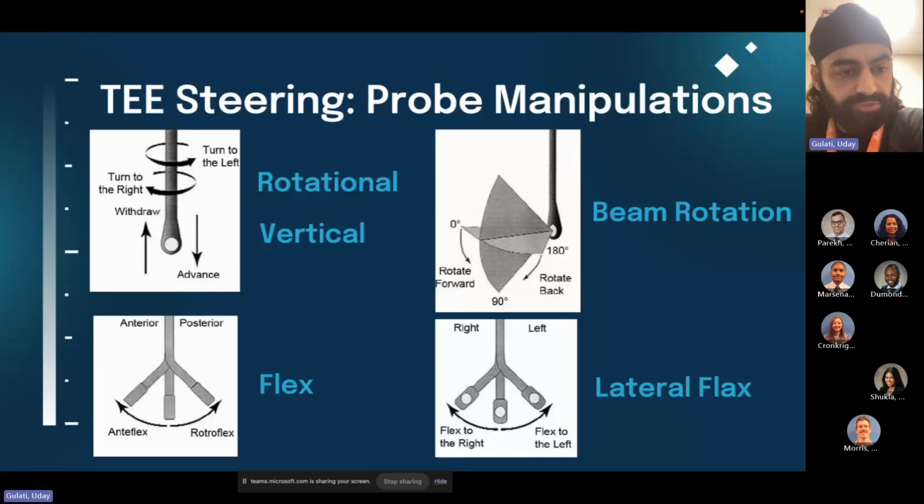So any questions on those 4 movements? Awesome. Yeah, so once again, there's 5 ways to maneuver. You'll primarily use 4, very, very controlled. And when you're using the probe, you're going to be able, at every point, to have specific instructions about exactly where you maneuvered your probe. That way, operator variance, there's going to be good control.